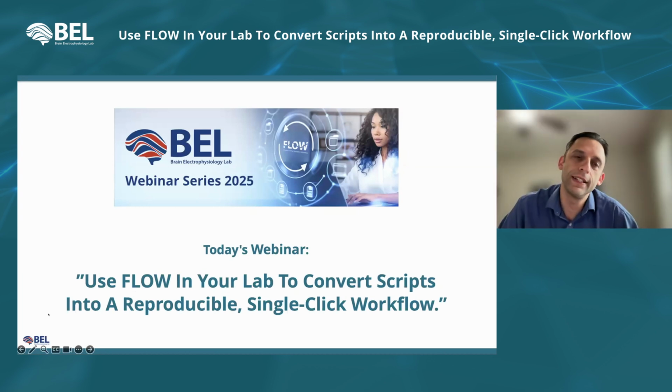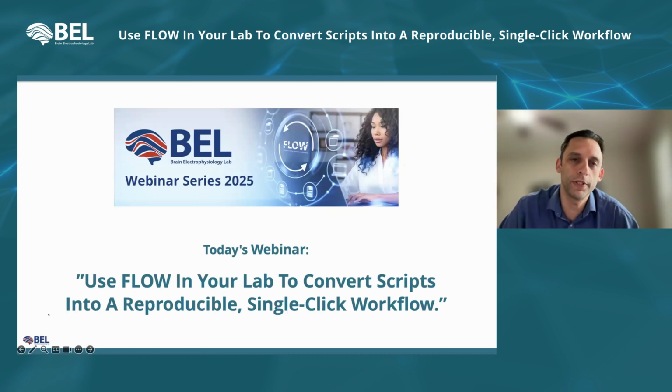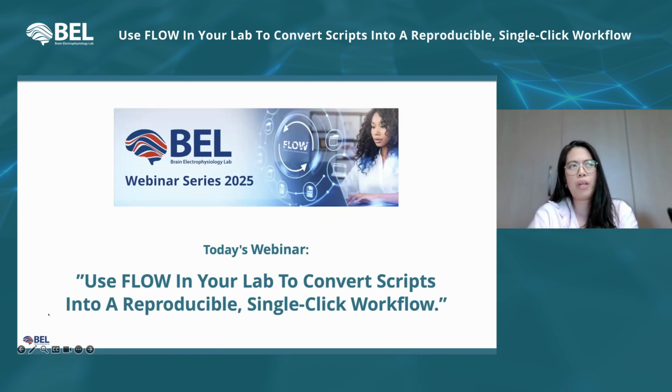A question from my side: if using GPU, would it speed up the processing? Yes, if we can perform parallel computation. It will require some more adaptation, right? Because it's Python code. What we did is we created our own functions because, in our experience, the MNE interpolation functions cannot be used in parallel computation. So we adapted our old pipeline in MATLAB and converted it to Python and adapted it for parallel computing.